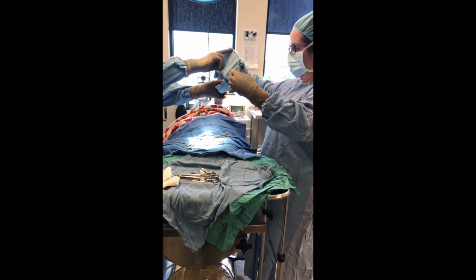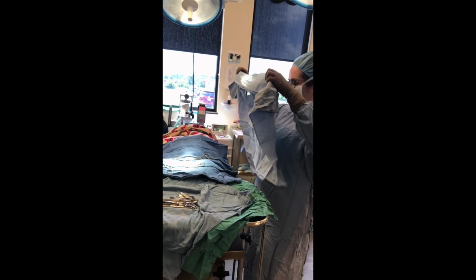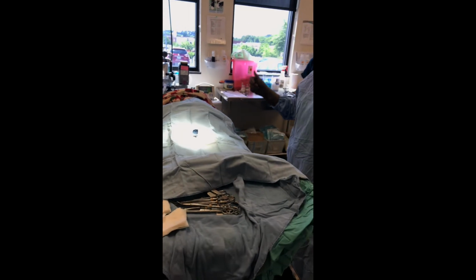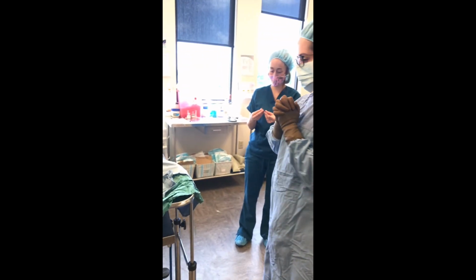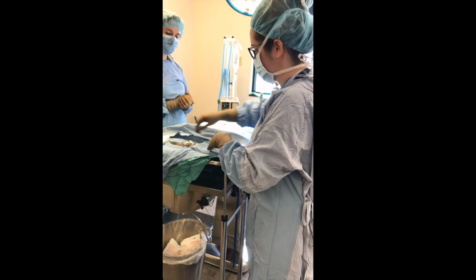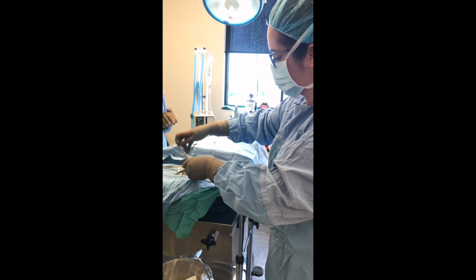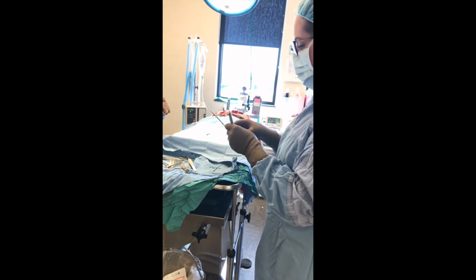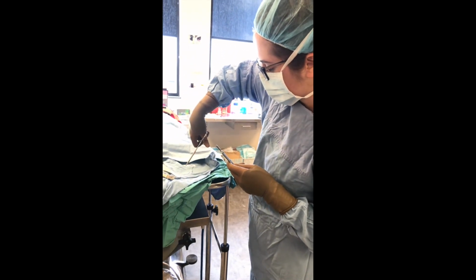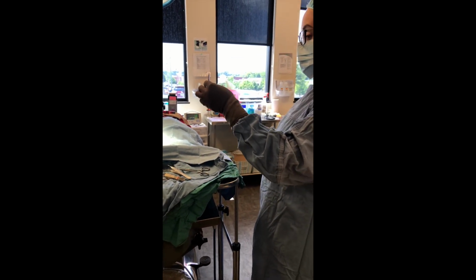It's right here. Okay. Place. Excellent.